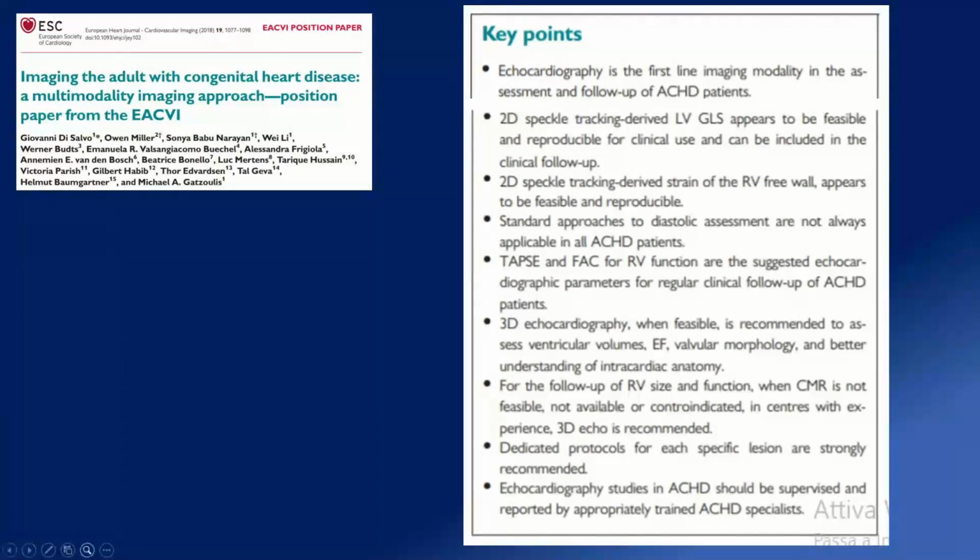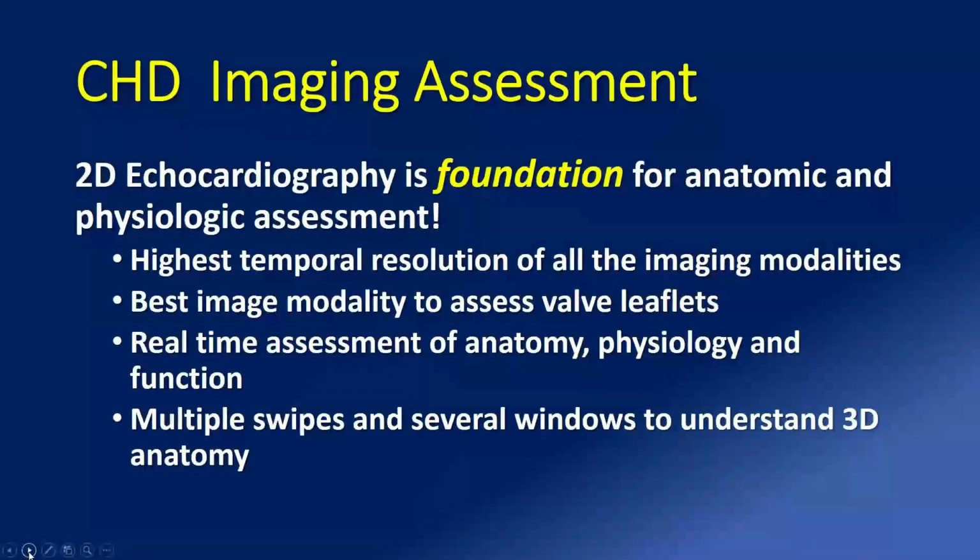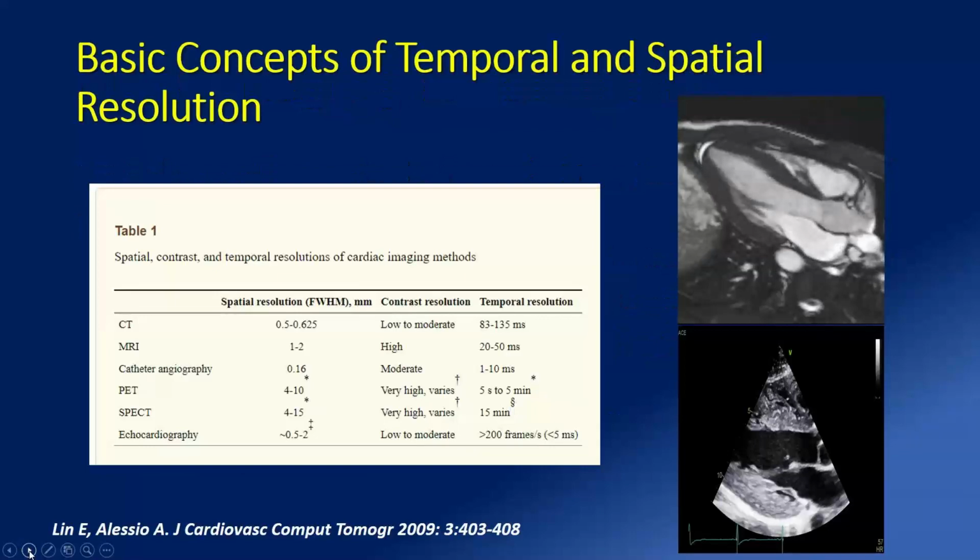Of course, 2D echocardiography is the foundation for anatomic and physiological assessment. 2D echocardiography is the technique with the highest temporal resolution of all the imaging modalities, and is the best imaging modality we have to assess valvular leaflets. It provides real-time assessment of anatomy, physiology, and function, and by adding multiple sweeps to the different windows, we can better understand 3D anatomy, even using 2D echocardiography.